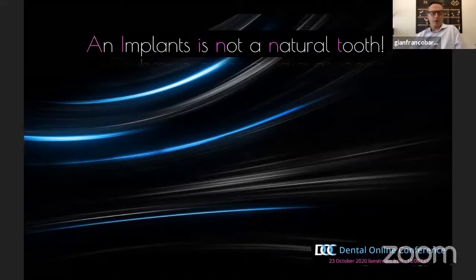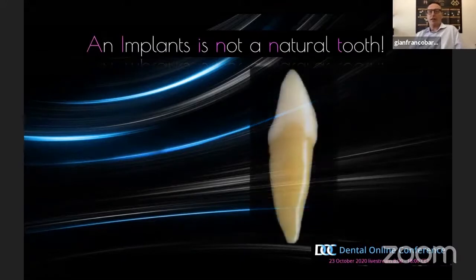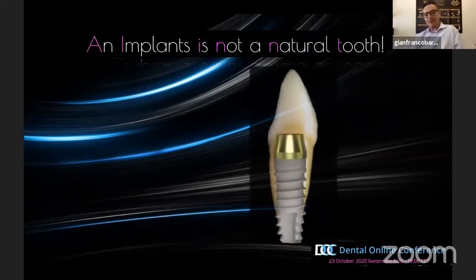First of all, we have to make clear that an implant is not a natural tooth. That means we have to consider the restoration on implants different from the restoration on a natural tooth, because in implants there are factors involved that make our work really different.